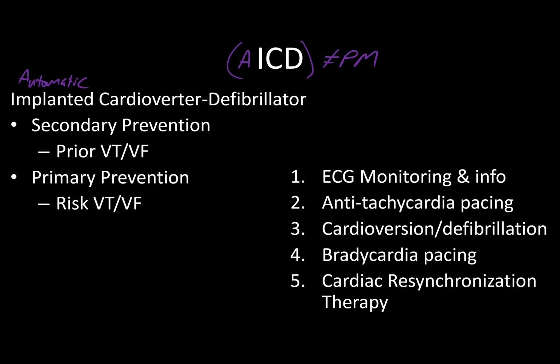It shocks them. Just like in a code blue. You put the pads on them and you zap them, right, to try and get them into a better rhythm. This does that, except it's implanted and automatic. It actually is reading the heart constantly, and then if it senses the appropriate parameters, goes, all right, let's get to it, and zaps them. So AICD, some people, in fact myself even, call it implanted cardiac defibrillator. That's probably a misnomer, but it's just one of those things that people tend to say.